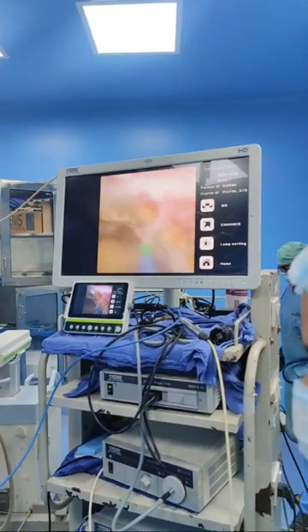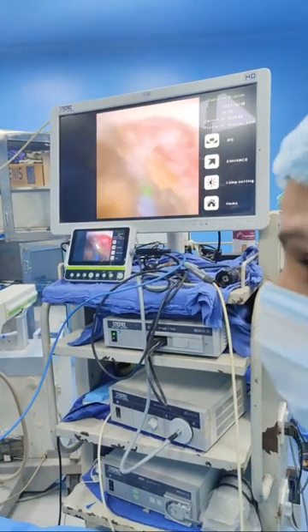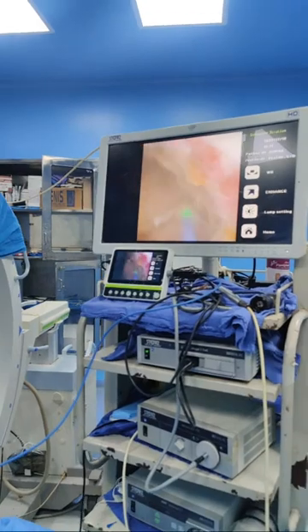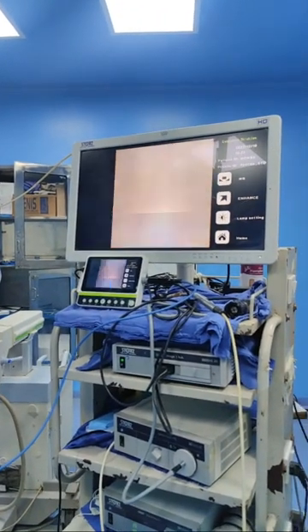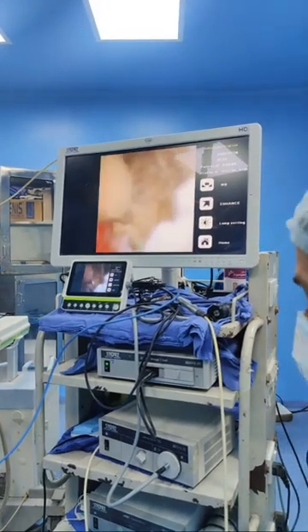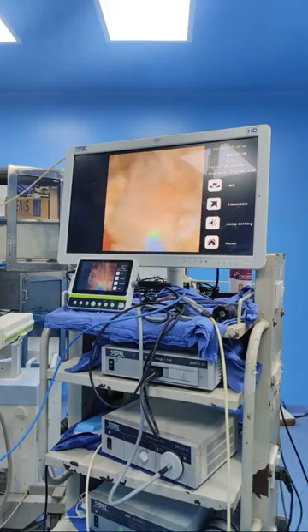Does the setting need to be changed, or is it perfectly okay, Dr. Kaushik? Yeah, it's perfectly okay. We are fragmenting at a very good speed. Only because of the size, we are taking time. We have a hard stone and that too staghorn.